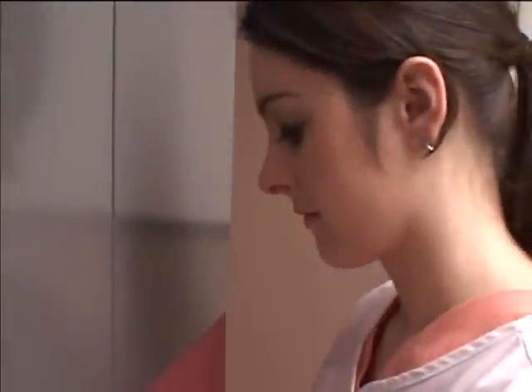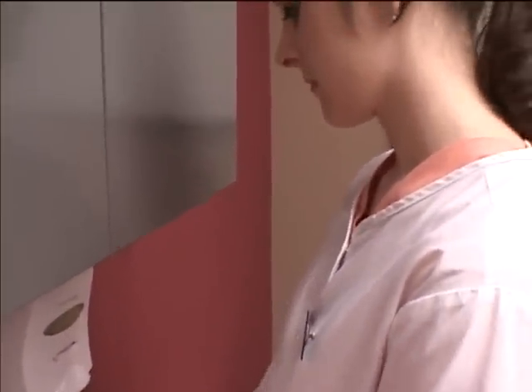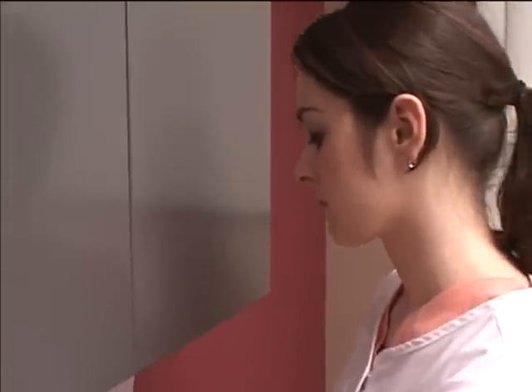Let's follow the medical assistant as she extracts medication into a syringe using several techniques. When ordered to withdraw medication from a vial for administration, you should begin by washing your hands.